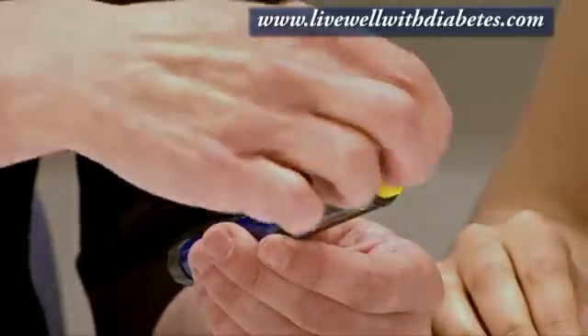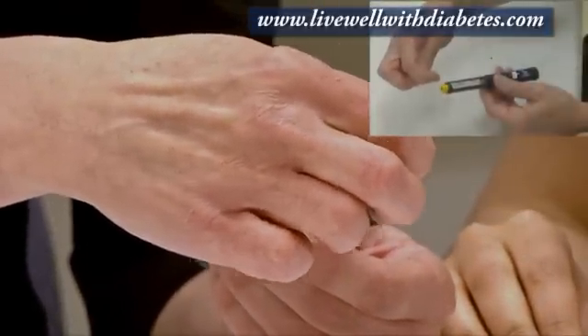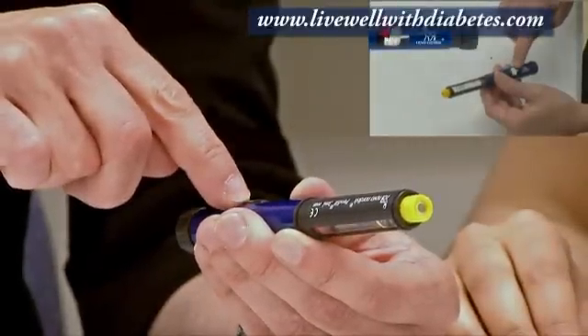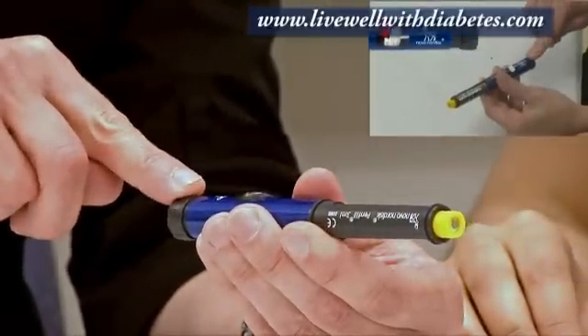On this end, where you see the threads are, that's where the insulin needle is going to fit. This is the dose indicator window, and on this section here is the dial.